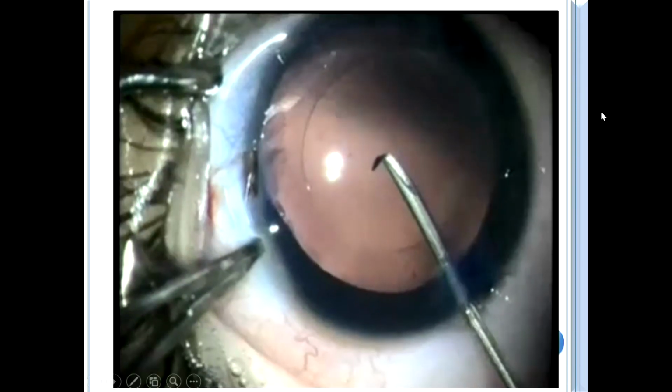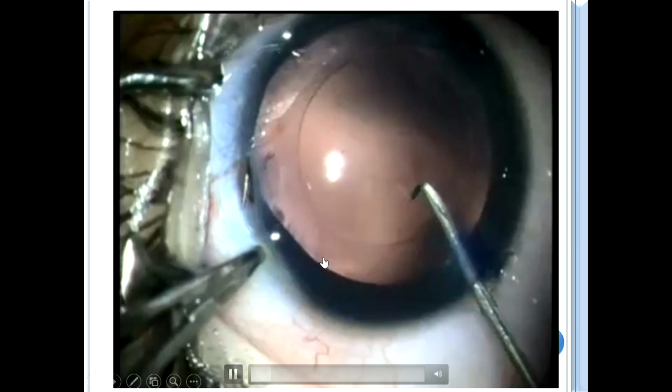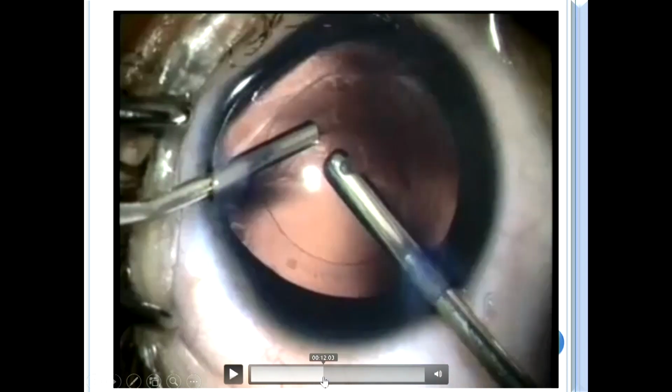Now, if you are keeping the patient aphakic, then in that case you can do a posterior capsulotomy even with a vitrector, and you can do it very easily.